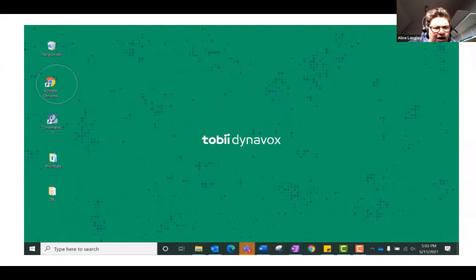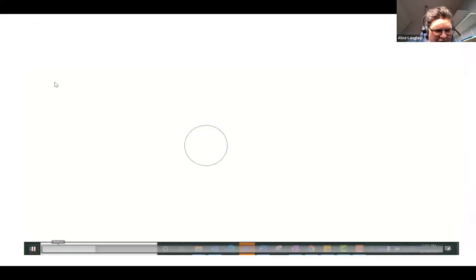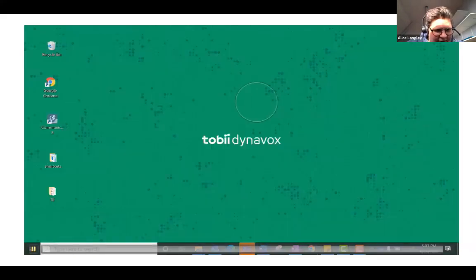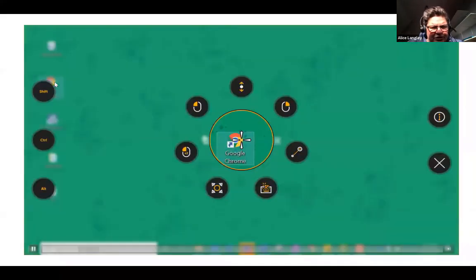There we go. So here, hopefully you'll be able to see there's a little circular trace here. And what that's done is, it's gone very quick. Hang on, let me just come back. Okay, so you'll see this circular trace here, which is tracking where our eyes are looking. You can see this user's gone over to Google Chrome. When you fix your gaze for X amount of time, and that is fully adjustable, it will then ask you if this is the area that you want to focus on, and you'll see that by this little dot popping up here. So yeah, that's where I want to look.